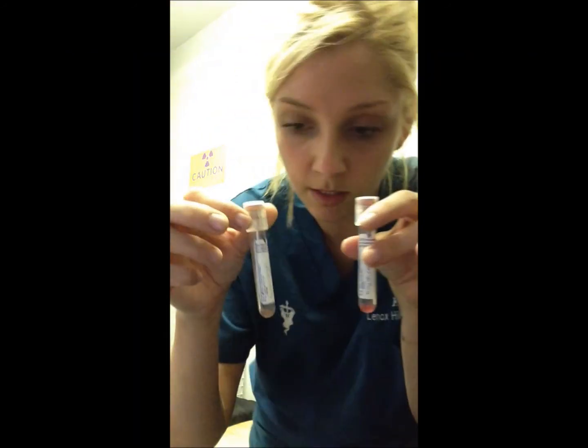So after completing the cross-matching agglutination test, we have the major cross-match and the minor cross-match. As you can see, the supernatant in the major cross-match is red, and the minor is slightly tinged pink, so these patients are not a match. You need to find another donor for the recipient.